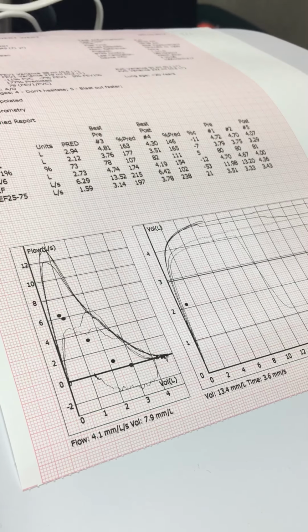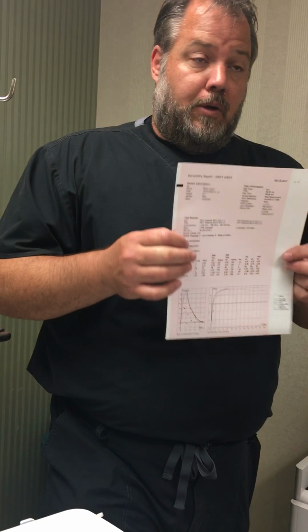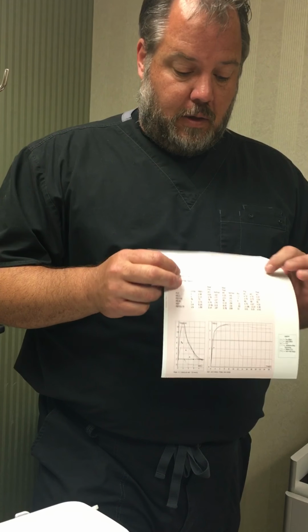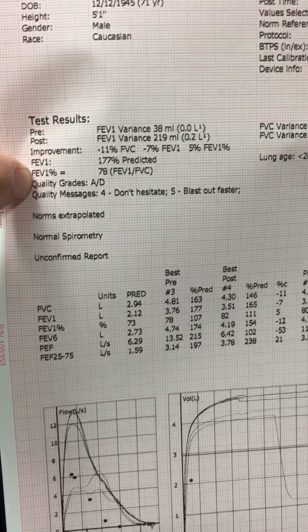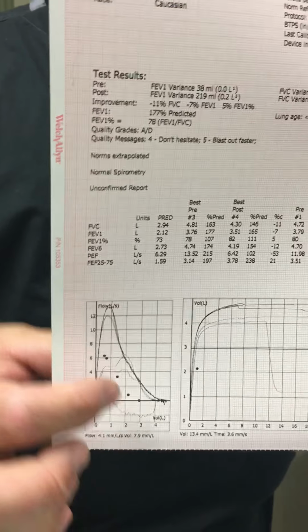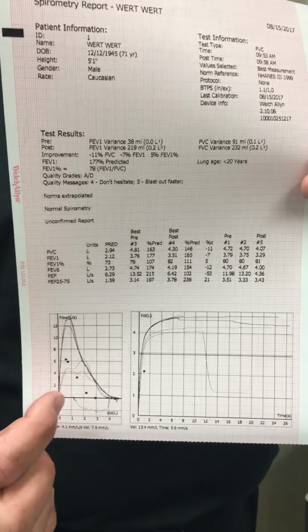The one thing, and I cannot stress this enough, you don't have to do it today, but whoever administers this test to a patient, make sure that when you do this test, you can get either an A or a B where it says quality grades. Here it says A and then D. D is my post-test because I don't have anything consistent, but A is my pre-test. So I had very consistent tests.